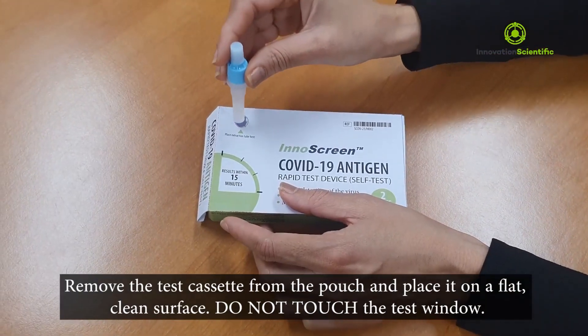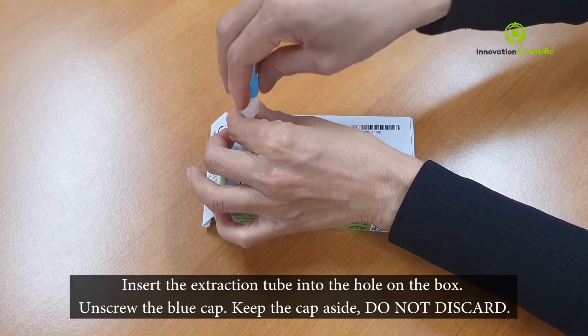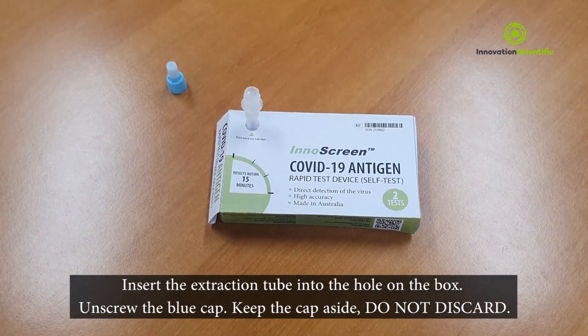Remove the test cassette from the pouch and place it on a clean surface. Do not touch the test window. Insert the extraction tube into the hole on the box. Unscrew the blue cap and keep the cap aside — do not discard it.